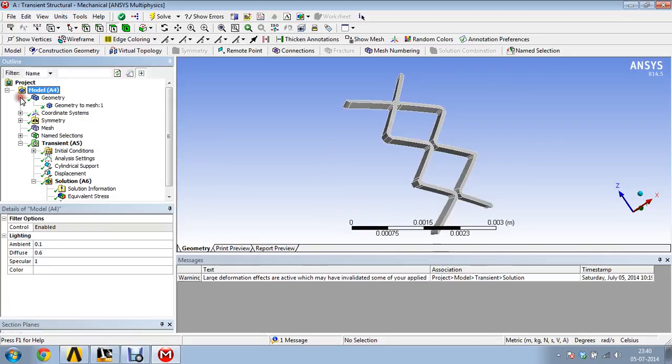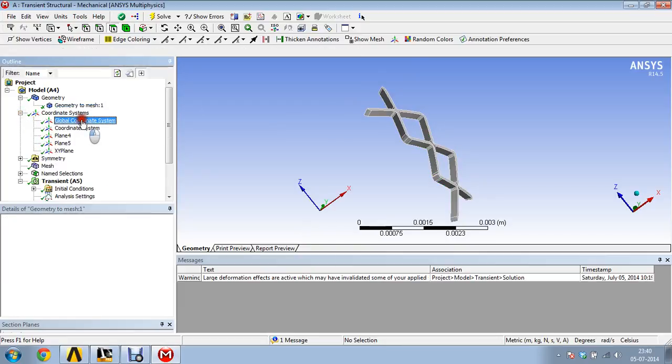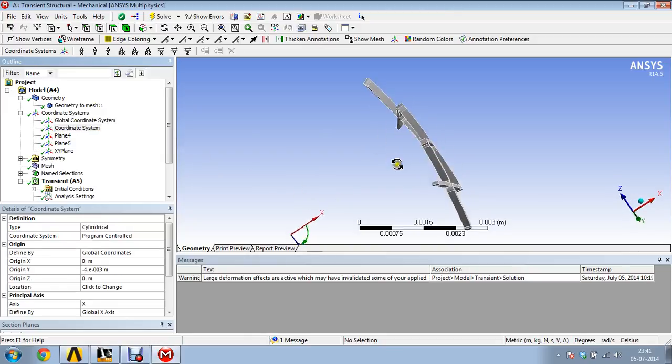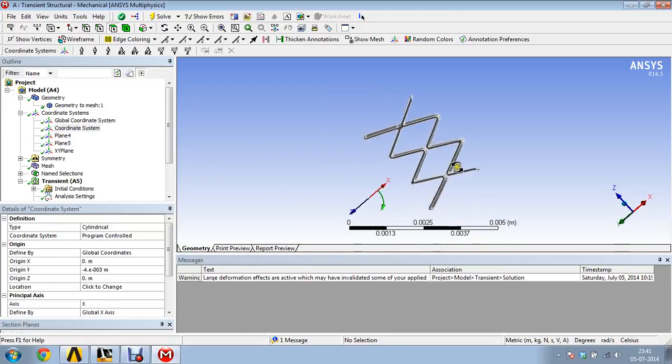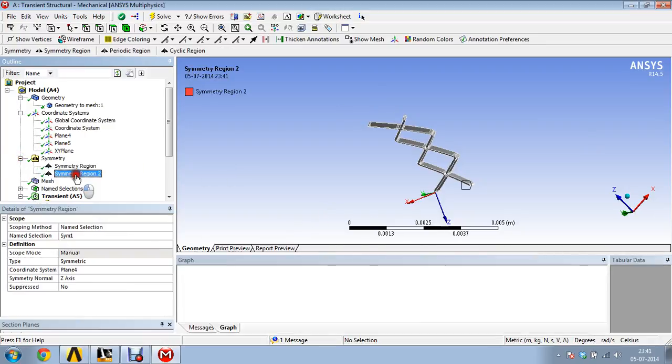Okay, so here this is a transient structural model and this is the geometry. There are many coordinate systems. This one is the global coordinate system, and this one is a cylindrical coordinate system, and this is plane 4 and plane 5, symmetrical planes which have been defined in the geometry module of this transient structural, and this is an XY plane. Now you can see there are symmetric regions defined.